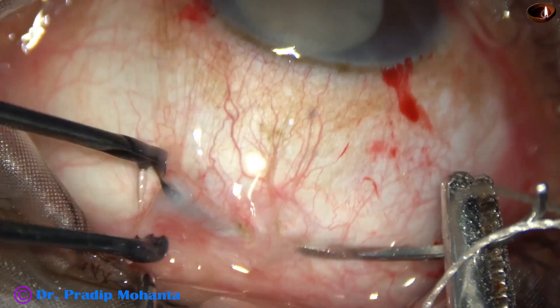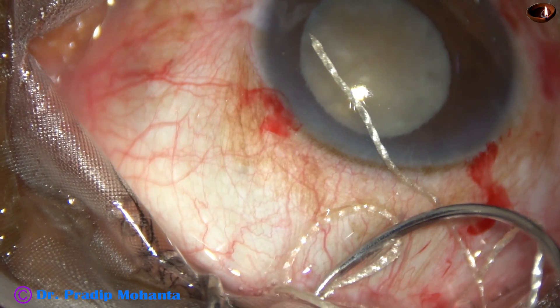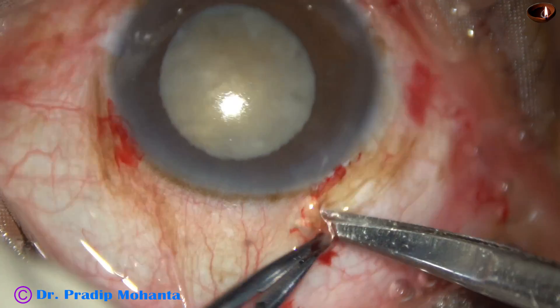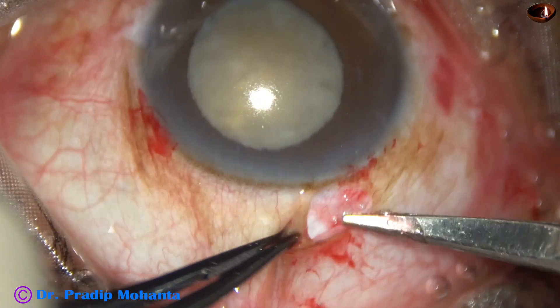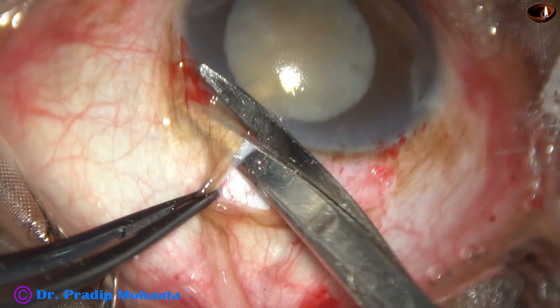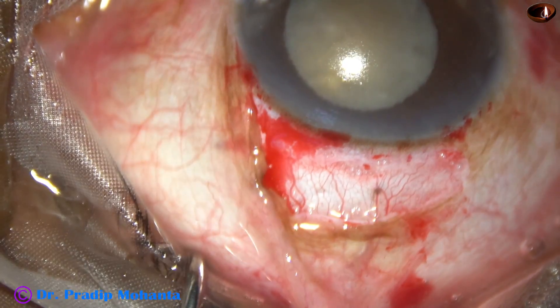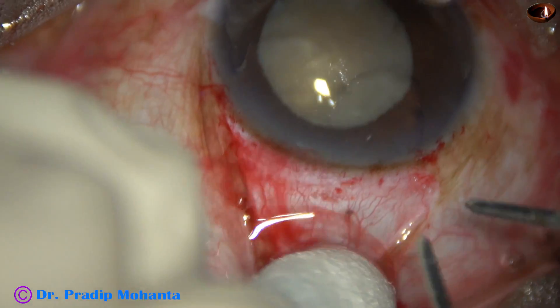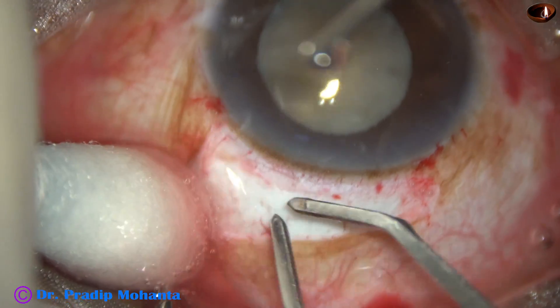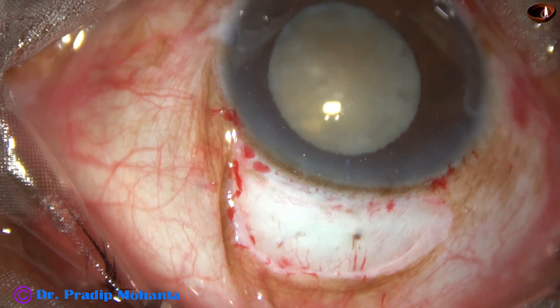The bridal suture helps in making the sclerocorneal tunnel — it keeps the eyeball stable so I can comfortably perform the tunnel. A small radial cut undermines the conjunctiva. In this case I find a thick Tenon's capsule underneath. We should cut along the limbus, and for bipolar cautery we should guard the margin of the conjunctiva with a bud.